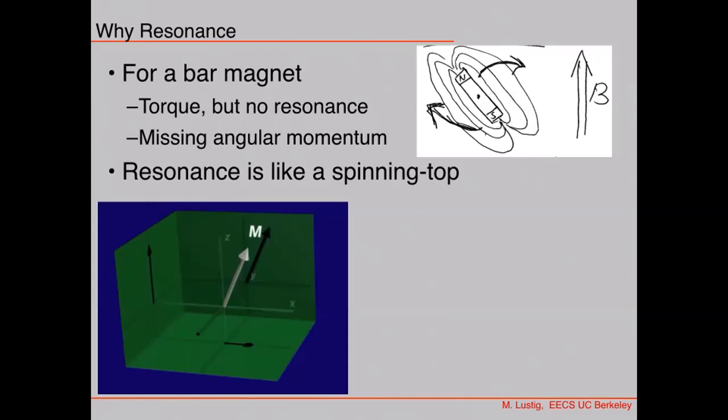Or you can put a magnetometer, but the problem there is the accuracy of these magnetometers. They're not that accurate at those fields. You can have a very accurate magnetometer around Earth field, but one that can measure parts per million accuracy is very difficult to make. Cool, thanks. That helps. We can use NMR in order to do that.